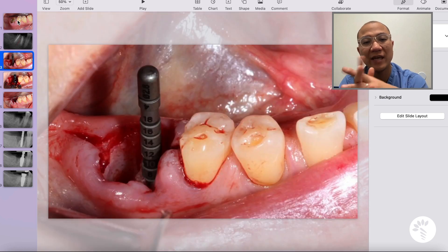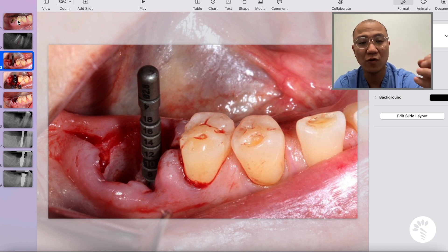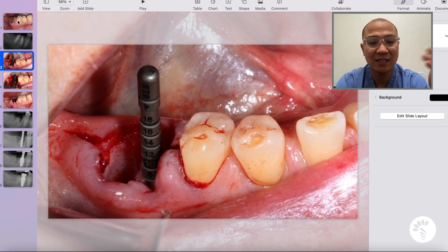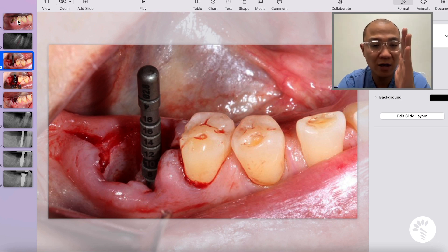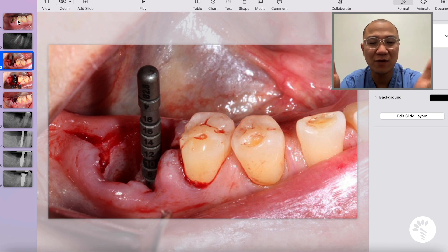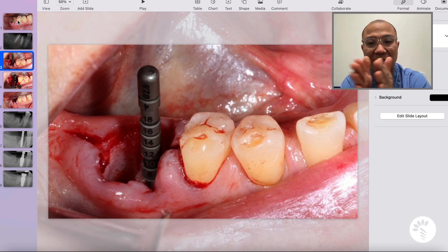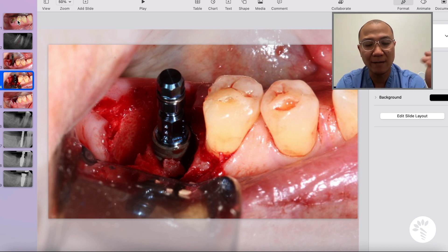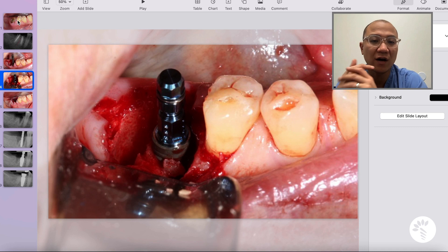After the tooth was taken out atraumatically without eliminating or grinding too much bone away, the initial osteotomy was performed and a guide pin was placed. You can clearly see that from the distal marginal ridge of the second premolar to the center of the pin is about 4 to 4.5 millimeters. The implant was then placed and you can see it's positioned between the mesial socket and the center of the septum.